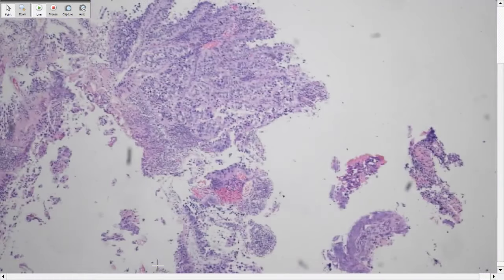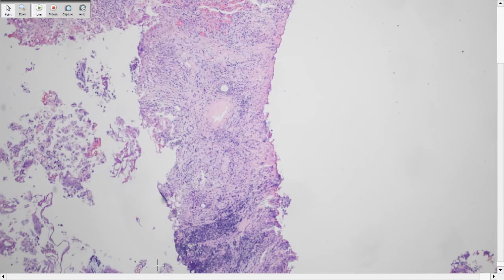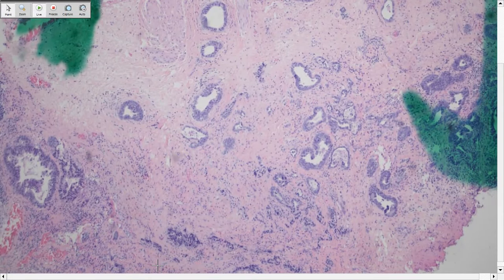There's another one. Find some better area. It's a typical urothelial carcinoma with inverted growth or whatever. What I want to show is this area. This looks like a glandular formation, ugly, right? This is not an inverted growth pattern, definitely invasive. Into muscularis propria already, right? Yeah, but this is ugly.